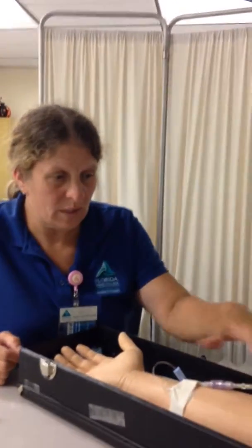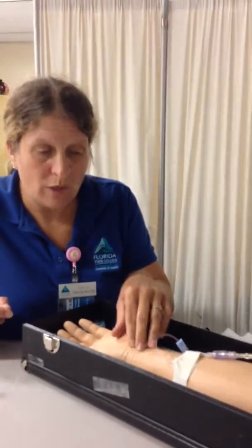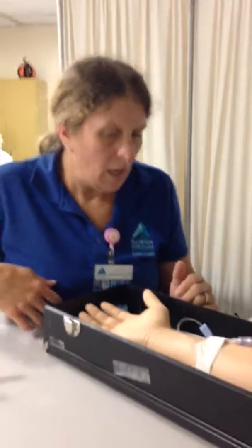I'm going to come in and introduce myself to the patient. I'm going to look at the IV. Of course, it's running. I'm going to ask them their name and date of birth, and I'm going to check it against their armband. I'm also going to instruct them that the doctor has ordered an antibiotic, and he's getting it every 8 hours.